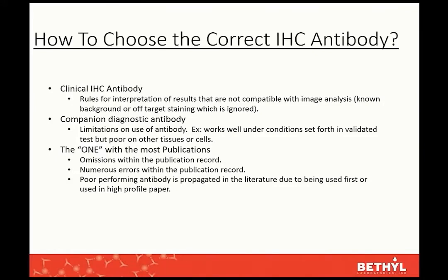However, there are actually limitations to that. But the one thing that most people report to us about how they pick a quality IHC antibody is that it's the one that has the most publications. And this is problematic in several ways.